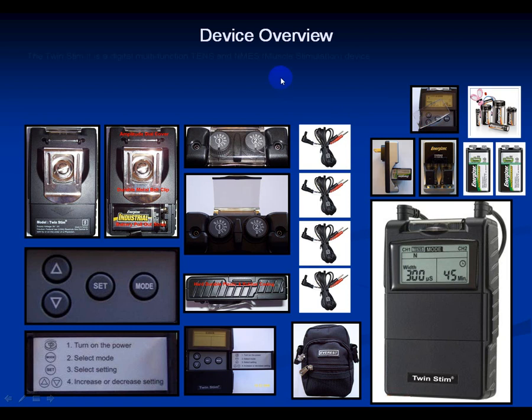Device Overview. The Twin Stem 2 is a digital multifunction TENS and Muscle Stem device with a digital screen that has a protective barrier over it. If the barrier comes off for any reason, put a little moisture on the screen and see if you can get the suction back on. Don't peel this off or let children peel this off.